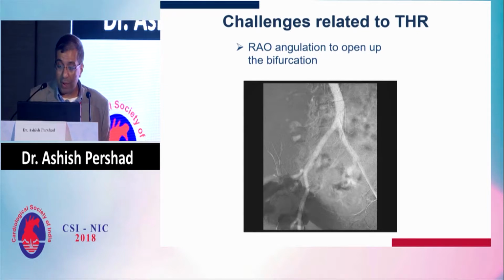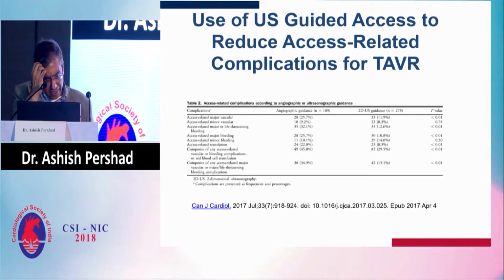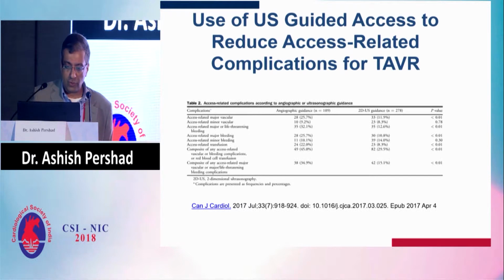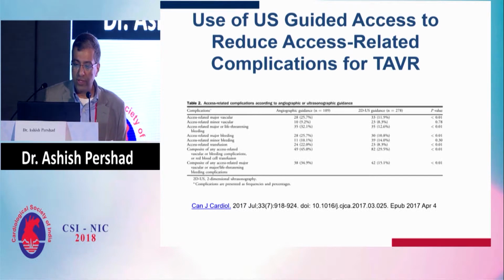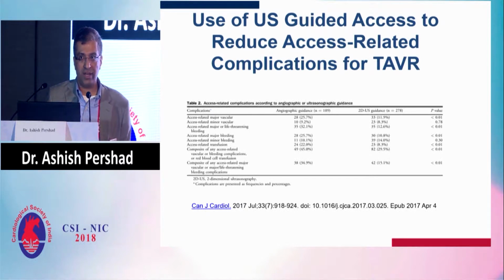A quick comment about ultrasound access. I think there's one publication from Canada last year that looked at the use of ultrasound guided access to reduce access related complications for TAVR. My only problem with this was that their complications with just angio related access was 25%. I think that seems a little bit outrageous. I don't think any of us have a 1 in 4 complication of accessing the common femoral artery, even if we did it blindly. So I think obviously it made ultrasound look a little better than it actually is.